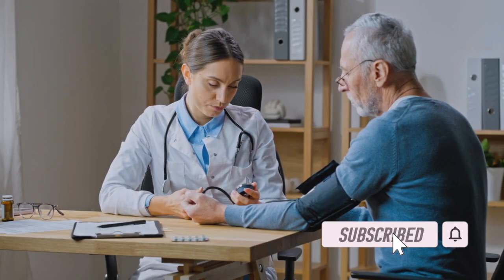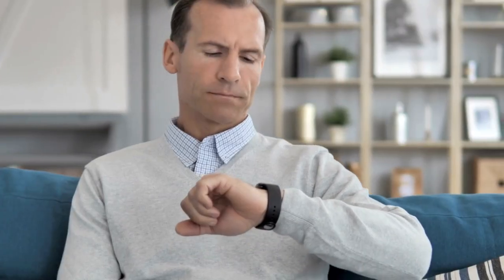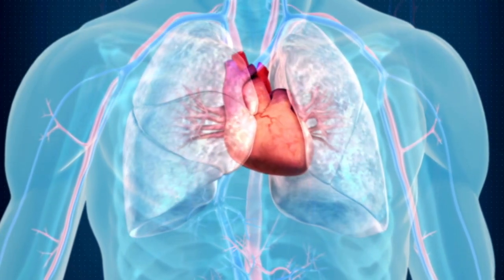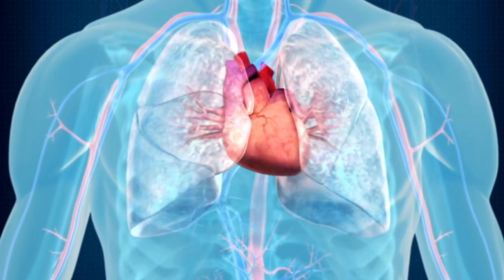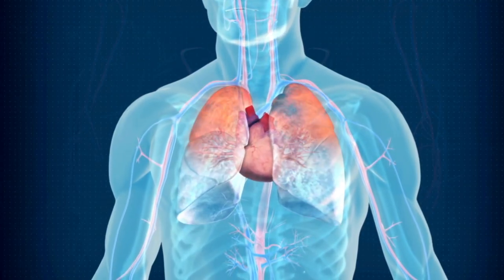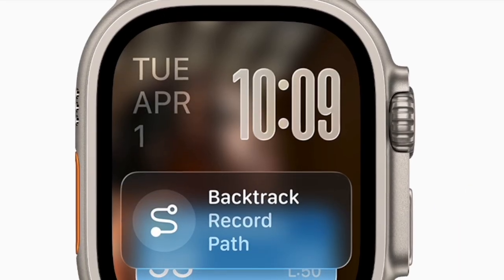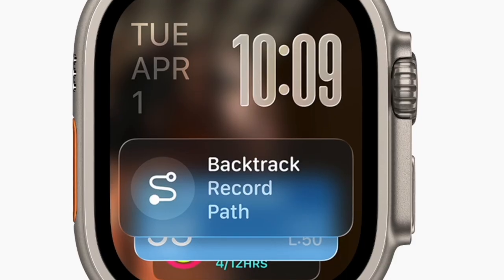Hi guys, welcome back. Let's talk about the right way to enable hypertension notifications on your Apple Watch. If you have a compatible Apple Watch model, your device can detect heart rhythm patterns that may indicate hypertension and send timely health alerts. This potentially life-saving feature can be activated with just a few quick steps. Let's get started.